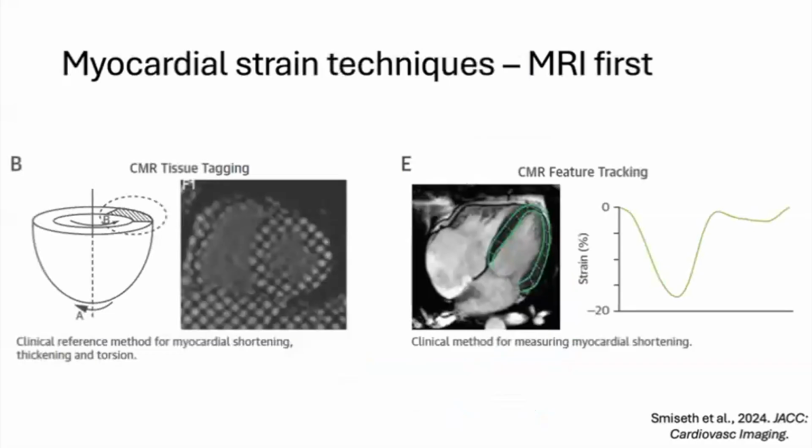In live human subjects, myocardial strain, with the help of advanced cardiac imaging, first emerged in the early 1990s, initially with cardiac MRI. And again, at this point and for the subsequent couple of decades, the focus remained entirely on the left ventricle. And so the first technology that came out was through using a series of radio frequency pulsations to form what was called tissue tagging, where basically certain parts of the myocardium would be labeled, and they track their movement over different planes.